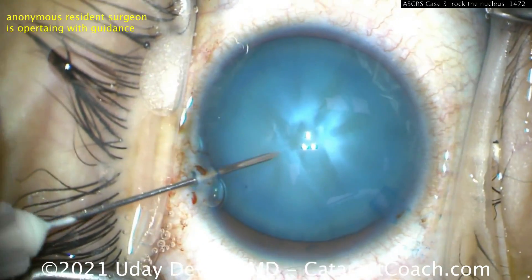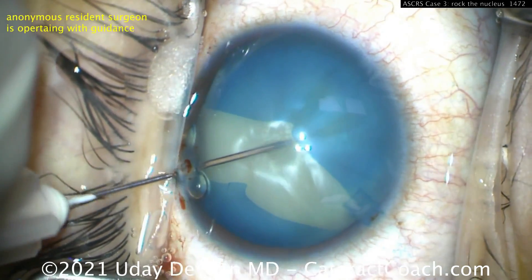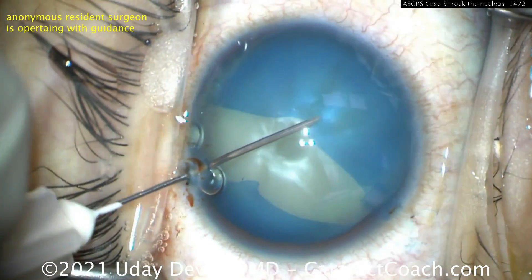That's going to pose an issue. You need to have the anterior chamber pressure higher than the intralenticular pressure, and if you don't — even if you try the needle decompression — you've seen it before, you know what happens.